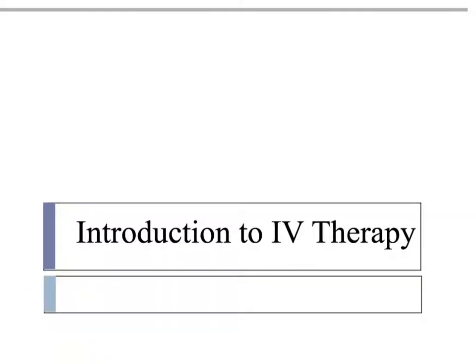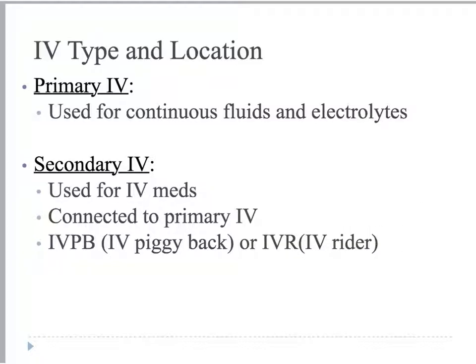Introduction to IV Therapy. In this video, I'm going to provide you with a little bit of background information on IVs. This will just give you a good idea of what's going on with different problems involving IVs with different drug calculations, just so you have some information about the tubing, about the setup, and so that you understand where the values are coming from for these flow rates.